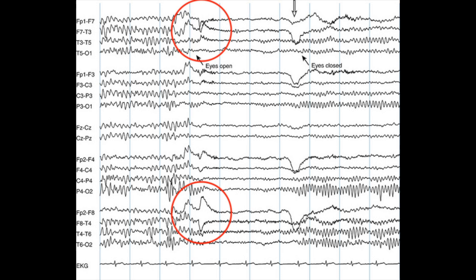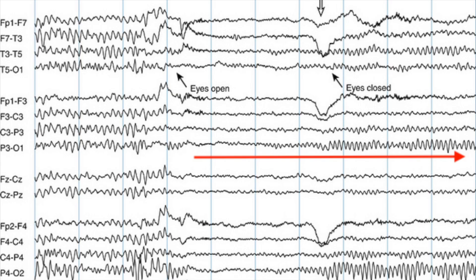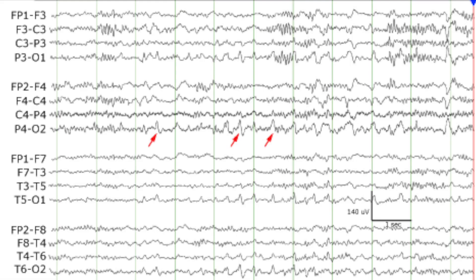Occasionally, alpha waves can cause confusion during EEG reading. They usually diminish in amplitude during eye opening, and the amplitude increases and becomes prominent during eye closing.